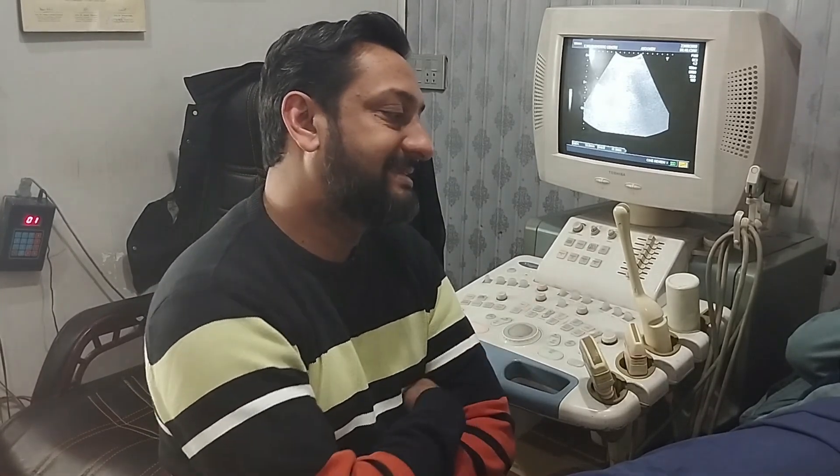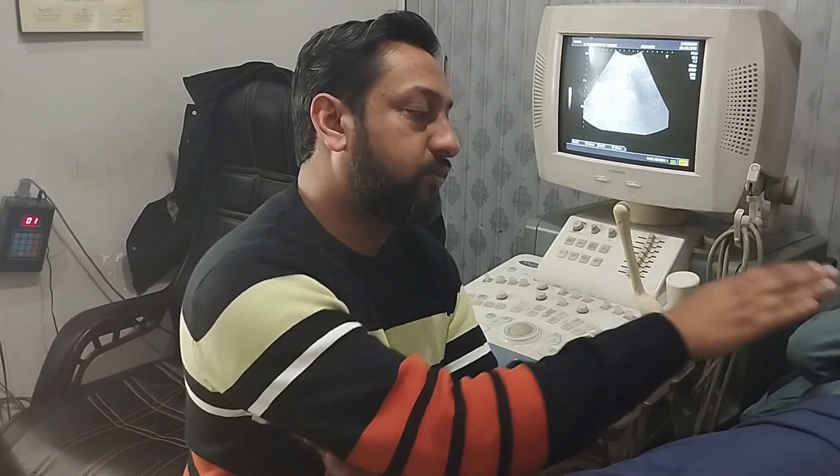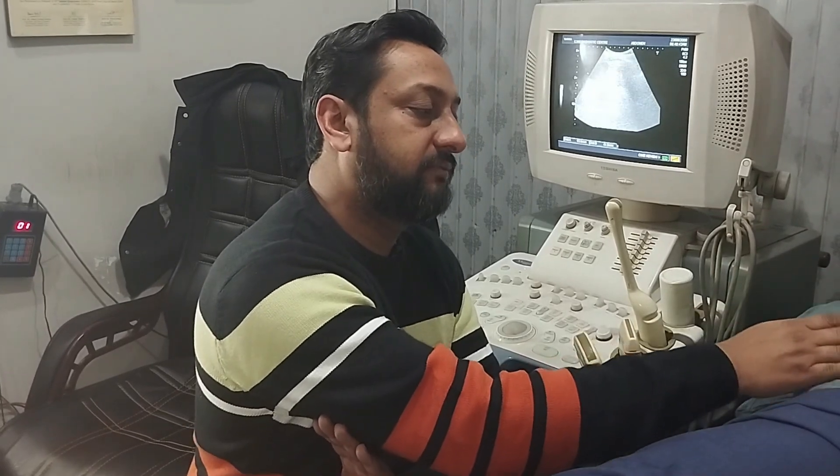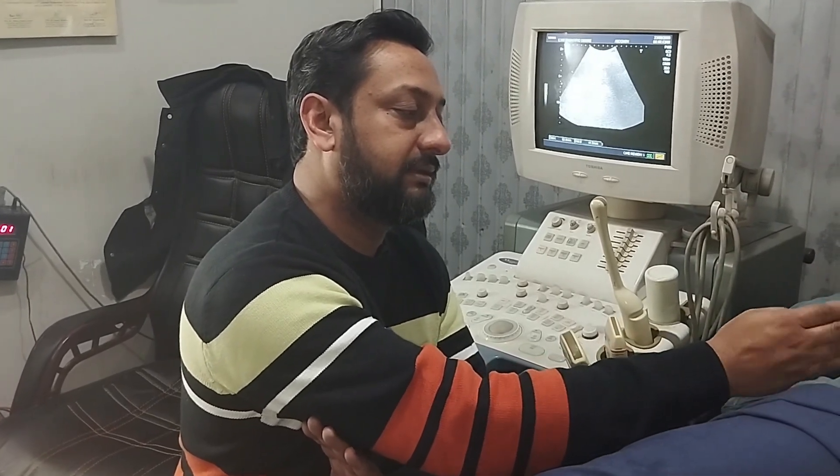You can see that the spleen is the organ for which I put my probe only at a single point and only tilted it backward, so my sound waves crossed under the rib cage.